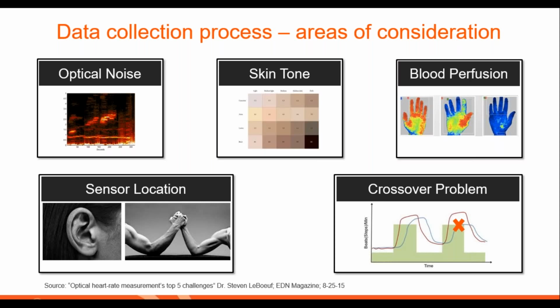We have this heat image of a hand. Somebody's hand and arm is very, very cold. Of course, that becomes more difficult. We're pretty successful in that, but there are times, especially with the arm, not so much the ear, that there may need to be some blood flow going during a session before we get really great signal, but most times we overcome that with our algorithms.